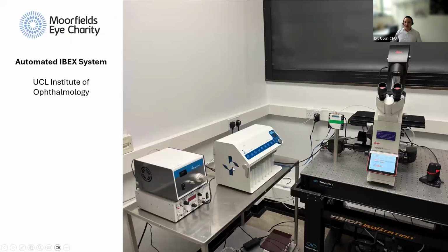And then this is a picture now of our setup in my lab in London that we were able to rebuild, hopefully just making the point that actually it's not really a huge footprint system either. You're not going to need a huge amount. You could squeeze this onto a bench. You could almost put it below as well. And these are the different elements.